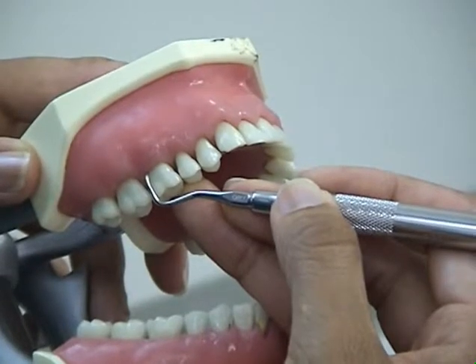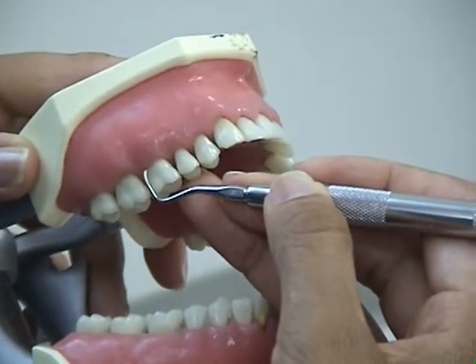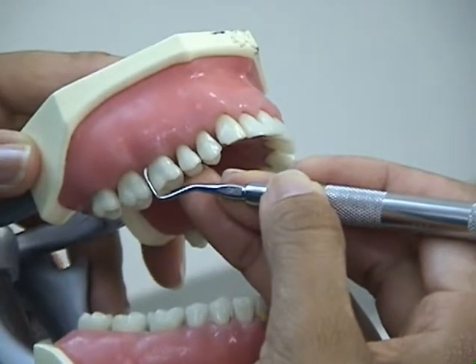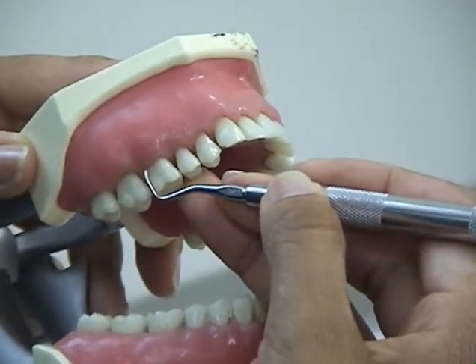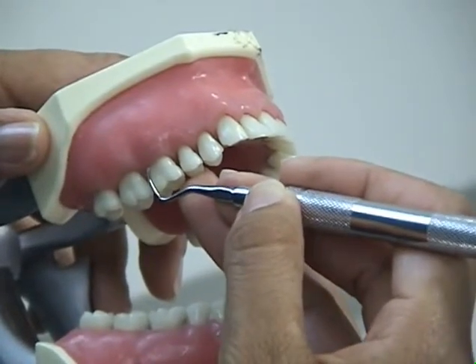For calculus removal, it is vital to establish a correct angle between the instrument and the tooth surface. Angulation for calculus removal is an angle of greater than 45 degrees and less than 90 degrees.